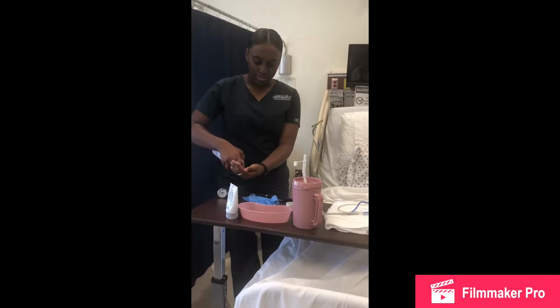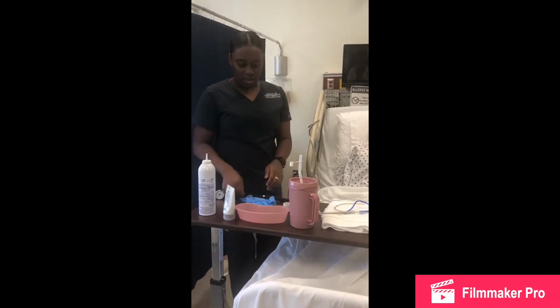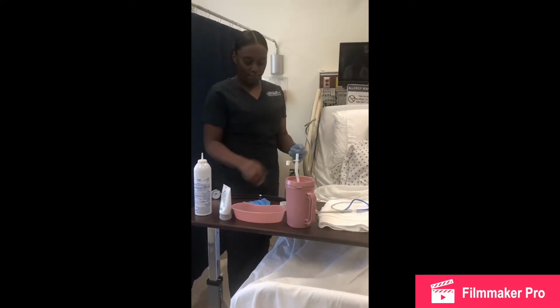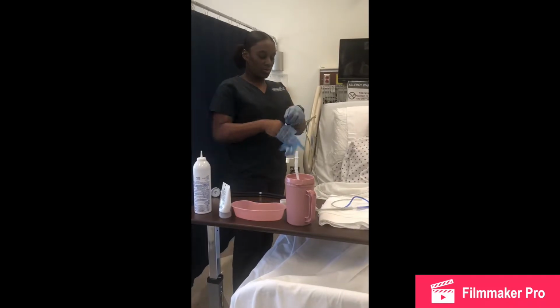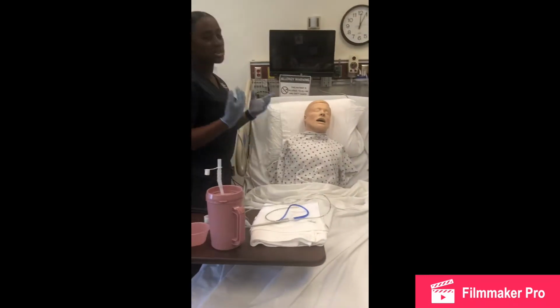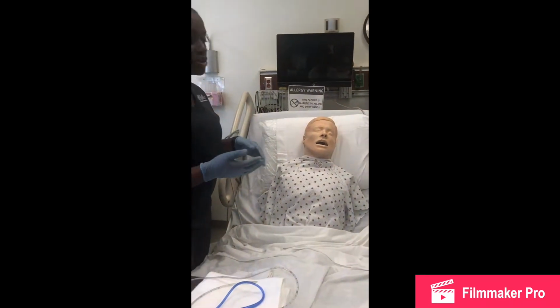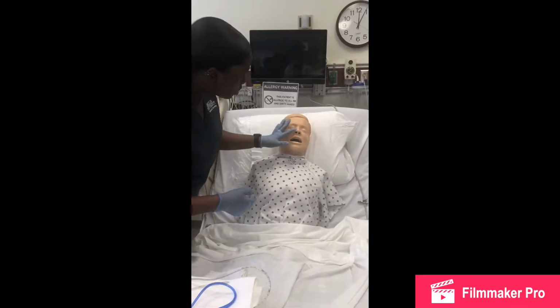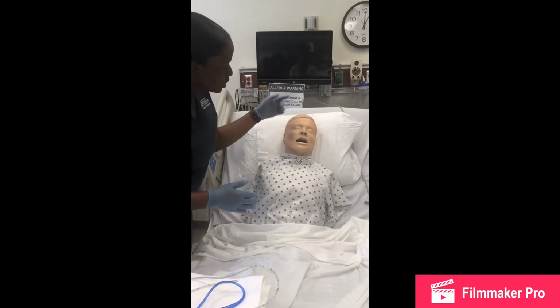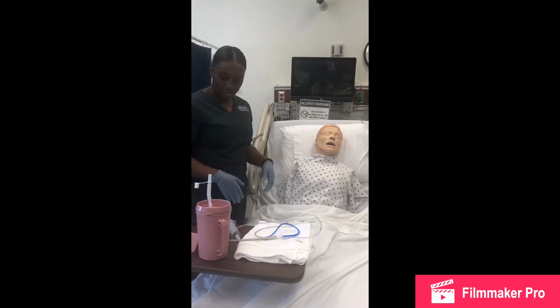Wash my hands again. Put my clean gloves on because this is a clean procedure, not a sterile procedure. I will then go over to the patient to assess his breathing to make sure which nose he's breathing properly through. So that's the nose we will enter through. I'll hold this part and ask him to breathe out. Hold this one and ask him to breathe out. So he's breathing more properly on his right side, so we'll insert through his right nostril.